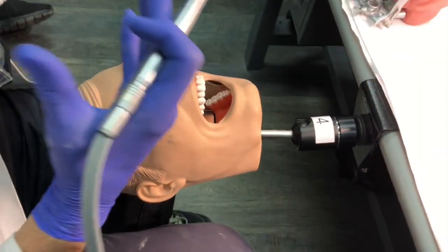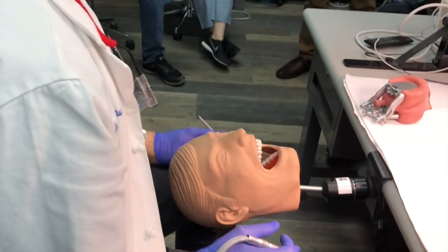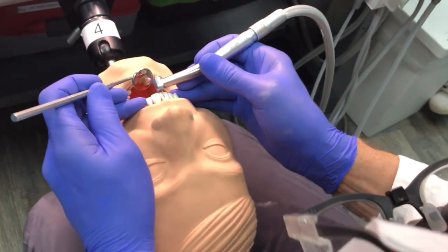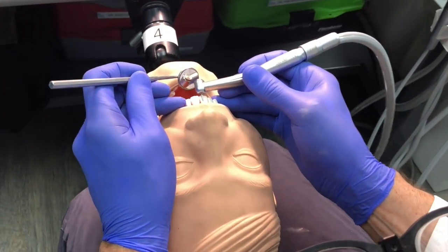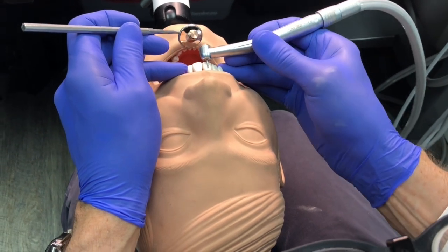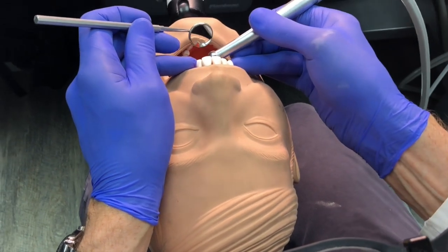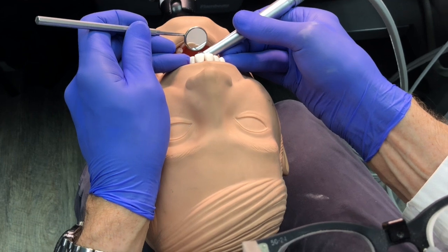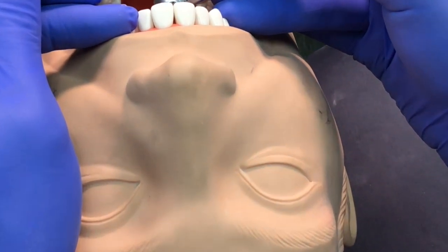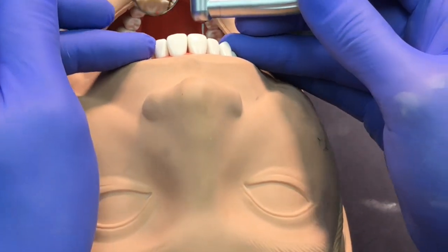If I'm going to approach the maxillary teeth for anterior crowns or anterior fillings, I'm always going to be sitting at 11 or 12 o'clock — it's a beautiful position. I can use the mirror to shine light on the case, to check how I'm holding my finger rest or positioning the handpiece along the long axis of the tooth. I can turn the handpiece and bur to the inside, looking in the mirror, and perform a Class III preparation very simply.